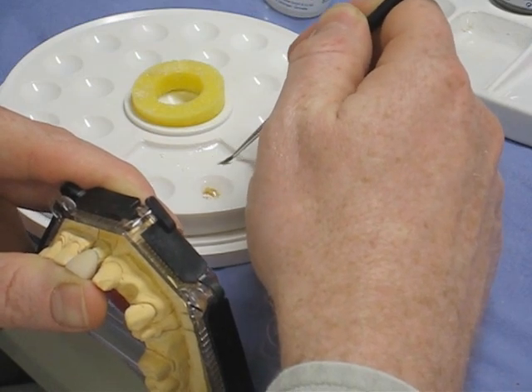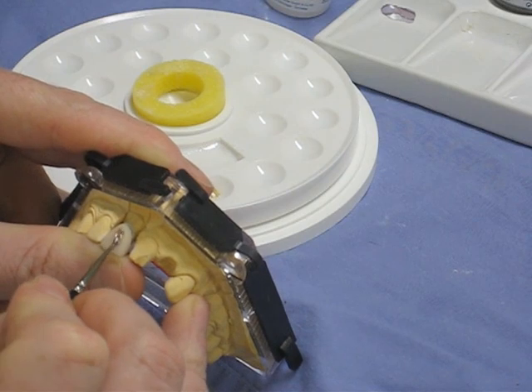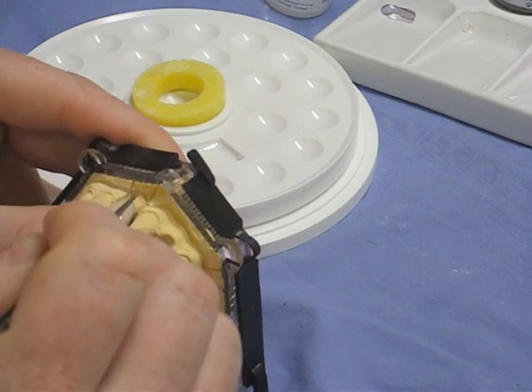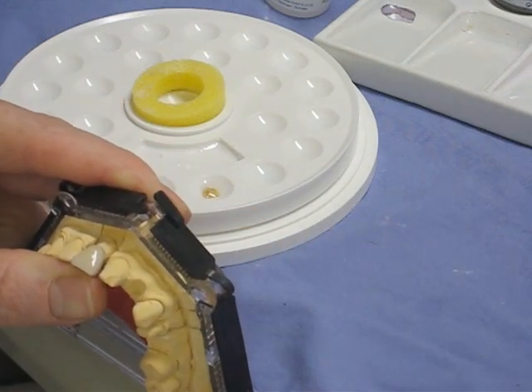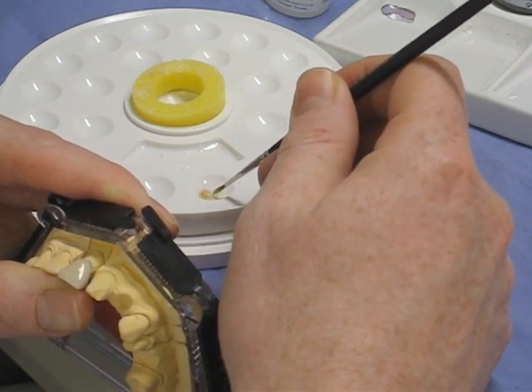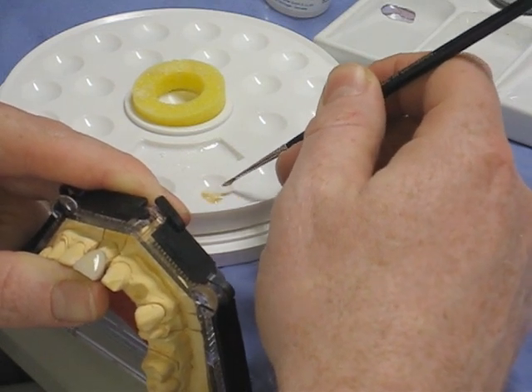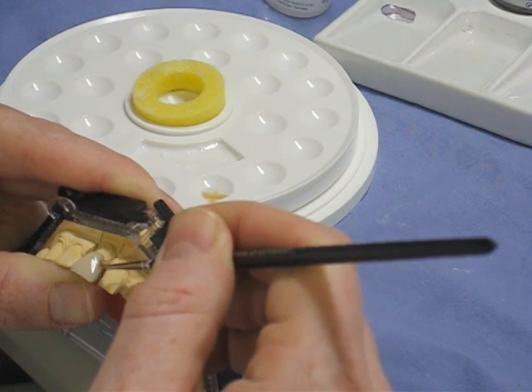A small brush is used for this stage. You don't have to put these glaze powders on — you can do what they call a self-glaze, and just put the crown through the porcelain furnace on a cycle without a vacuum, which allows all the glasses to come to the surface, giving a lower sheen. This glaze powder method is for a highly glossy one, probably more preferable to an older patient.